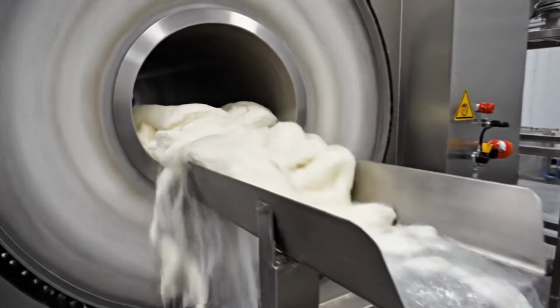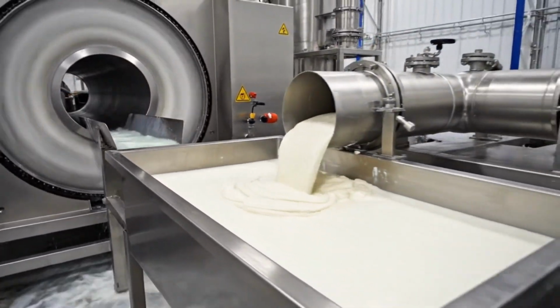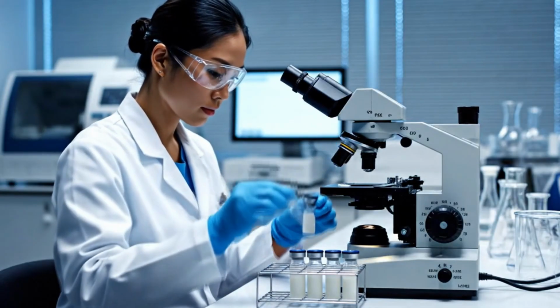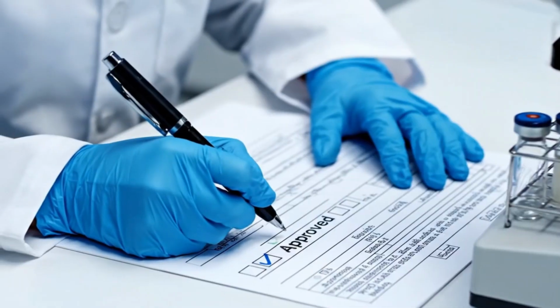By spinning the latex, we create a concentrate that is stronger and more durable for the dipping process. We test for purity and protein levels. Only the cleanest latex can move forward to become a medical-grade barrier.